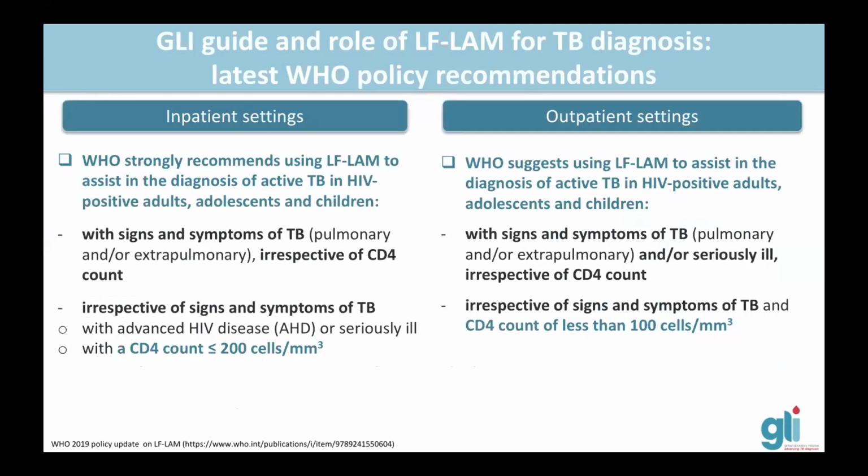So when it comes to the diagnostic algorithm, this is, as I mentioned, aligned with the latest WHO guidance released in 2019. And WHO has recommended the use of lateral-flow LAM for inpatient settings and outpatient settings. And there is some little variation depending on these two populations. So in inpatient settings, WHO strongly recommends the use of lateral-flow LAM to assist in TB diagnosis in people living with HIV, all ages, with signs and symptoms of TB, irrespective of CD4 count.